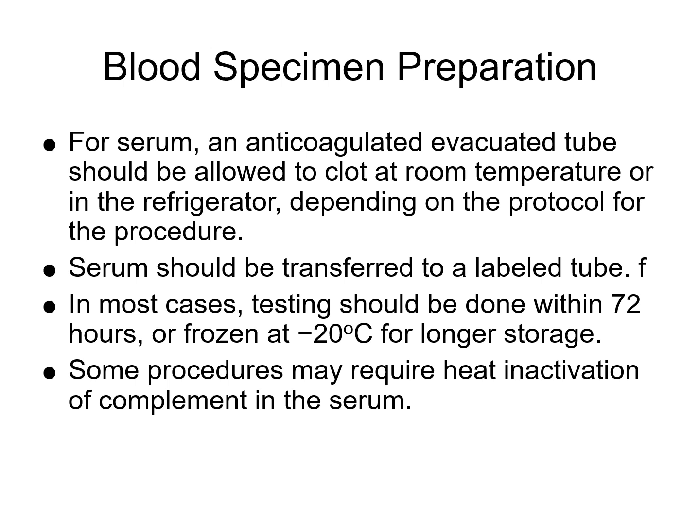that is going into that tube. For storage and testing, for short-term storage, the testing should ideally be completed within 72 hours of collection. For long-term storage, beyond 72 hours, generally you can freeze it at -20 degrees Celsius or according, once again, to that specific protocol. We want to avoid repeated freeze-thaw cycles to help maintain that sample integrity.